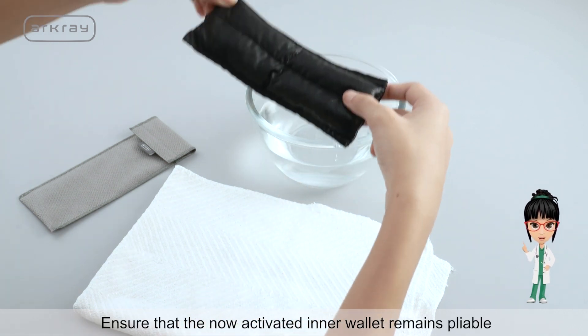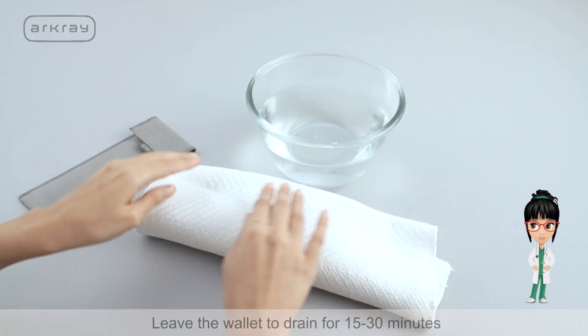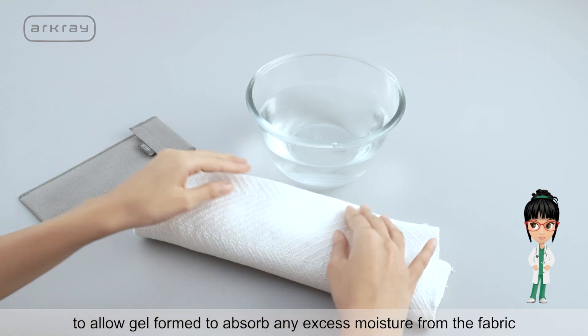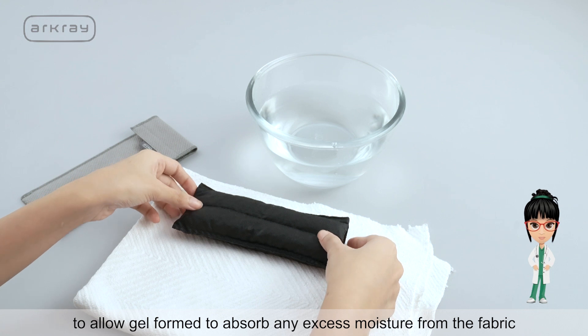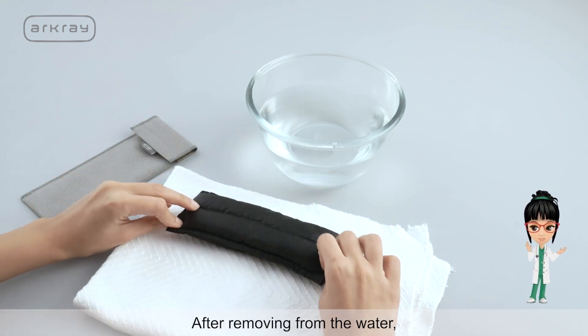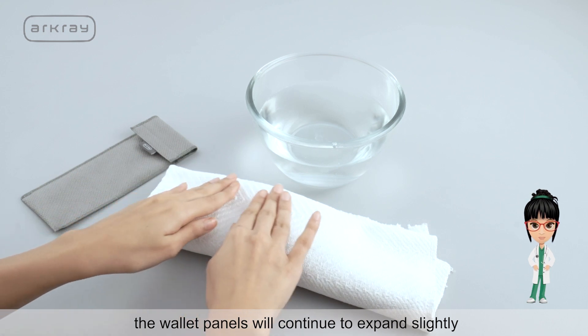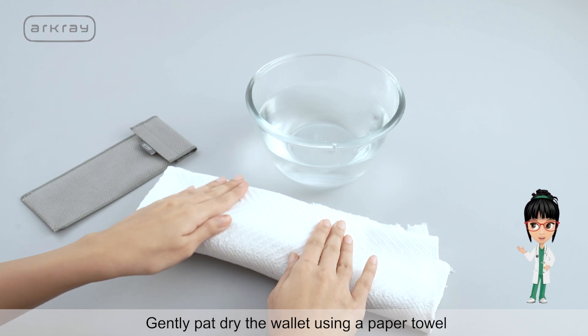Soaking will lead to formation of gel which will fill the expanding panels. Ensure that the now activated inner wallet remains pliable. Leave the wallet to drain for 15 to 30 minutes to allow the gel formed to absorb any excess moisture from the fabric. After removing from the water, the wallet panels will continue to expand slightly. Gently pat dry the wallet using a paper towel.